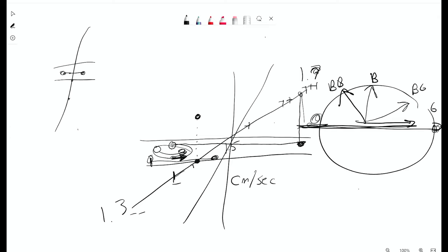And so in this case, GE and Siemens both do it opposite. Oh, of course. So it's like window leveling. In this case, this is bright. In this case, this is dark. Right. And so you'll see on a phase contrast image, in this case, think about my aorta. If I have my aorta and I turned on my Venc to be head to foot, let's say this one's going up. So this is going to be bright and this one's coming down and it's going to be dark.